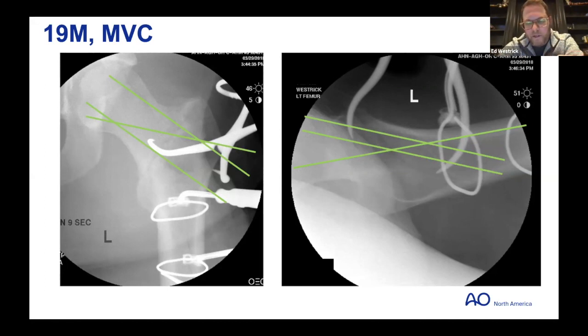I won't final tension them until the final implants are in. But in these cases, I need those tensioning devices out of there. They're in the way of our imaging, the aiming arm, the clamps and whatnot. So I would say these are more for just maintaining the reduction. I think of these just like little round clamps that I can leave in there, as opposed to revision arthroplasty where maybe I'm applying more force to it.